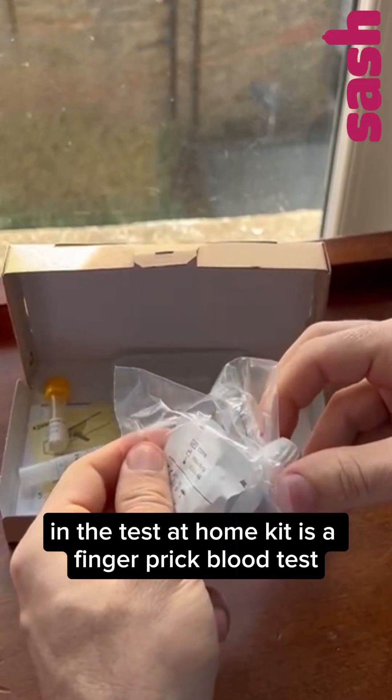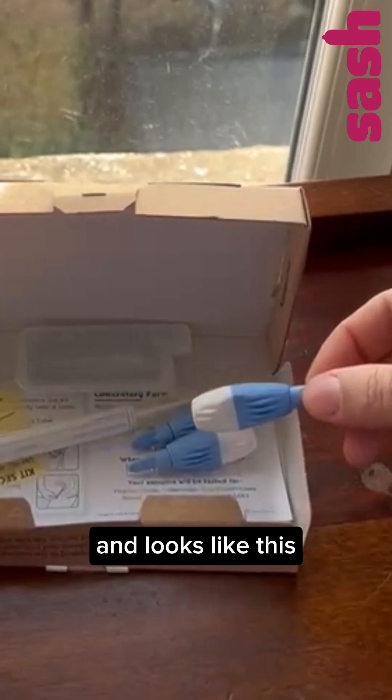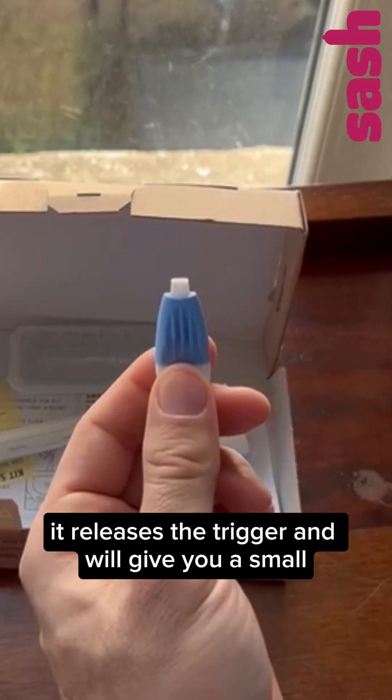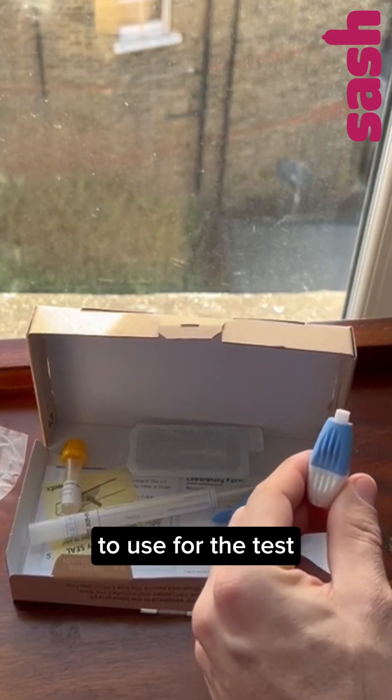The HIV test in a test at home kit is a finger prick blood test and looks like this. They have a small needle inside, but when you push the safety needle against your finger, it releases the trigger and will give you a small, quick finger prick, allowing you to produce a small amount of blood to use for the test.